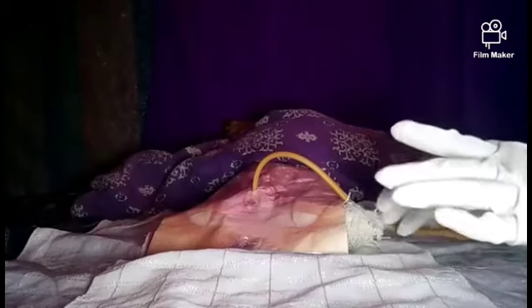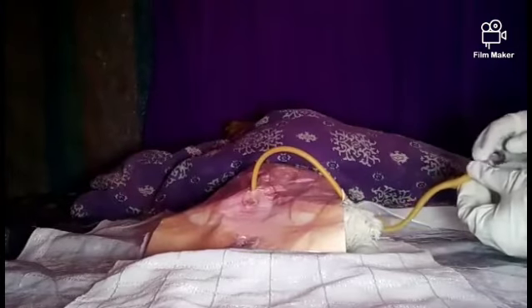Place the absorbent towel on the mattress under the catheter to protect the bed linens from moisture. Get the syringe, attach it to the balloon port, and withdraw all the water or solution from the balloon.